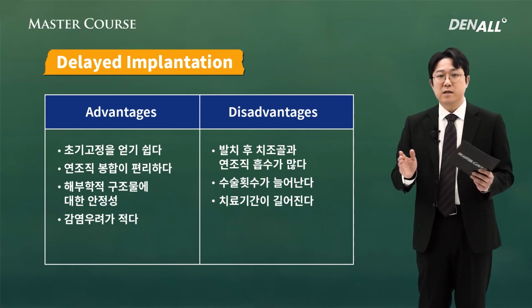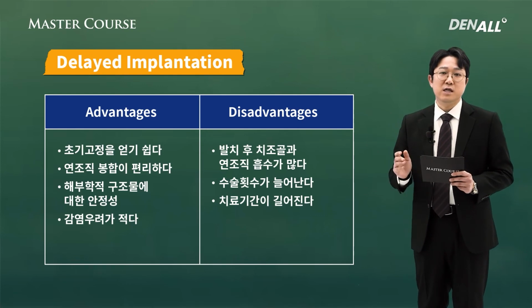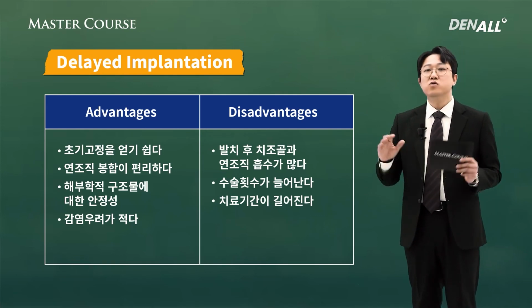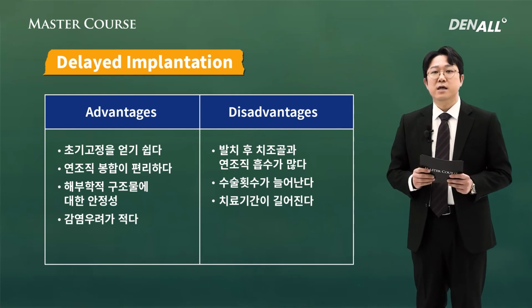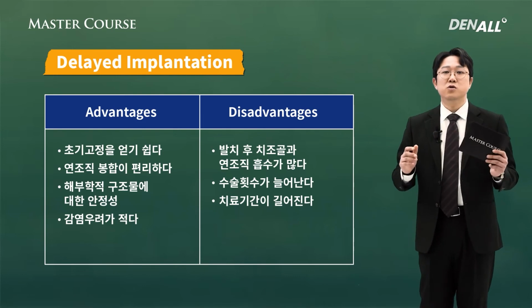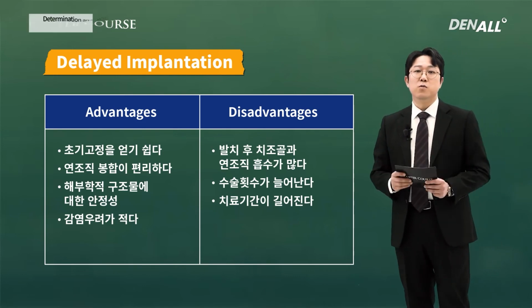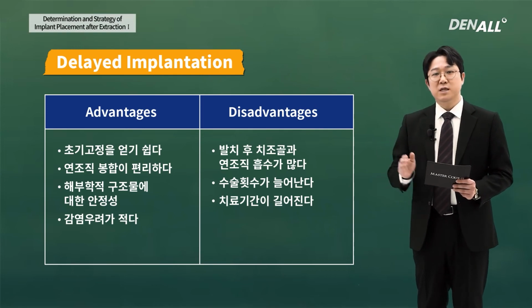And after extraction, as you wait for socket healing, this is not just for healing, but to get an optimum result. You need to explain this to the patient, and if you provide sufficient explanation and form a strategic partnership with the patient, they will understand the long wait.